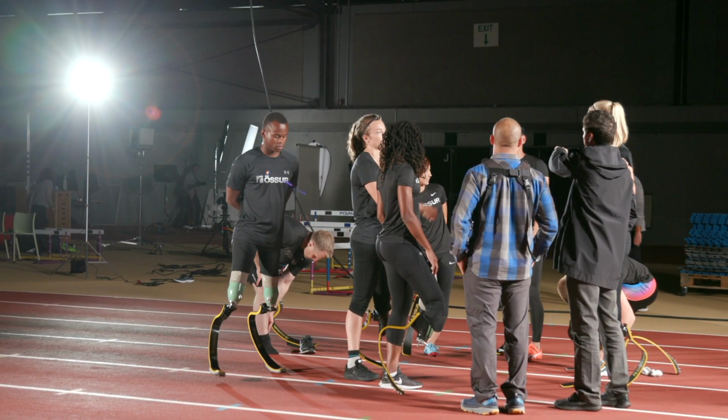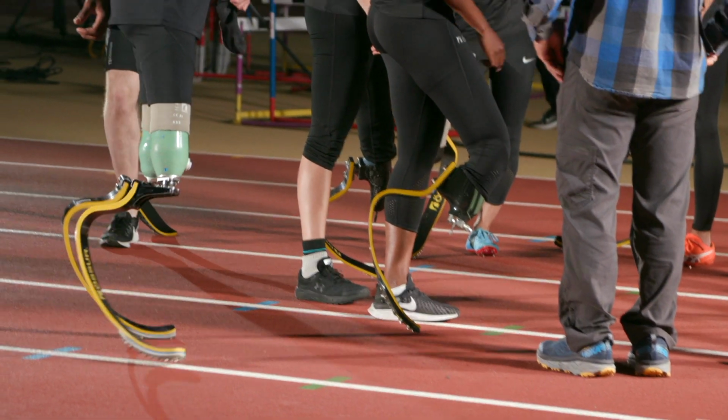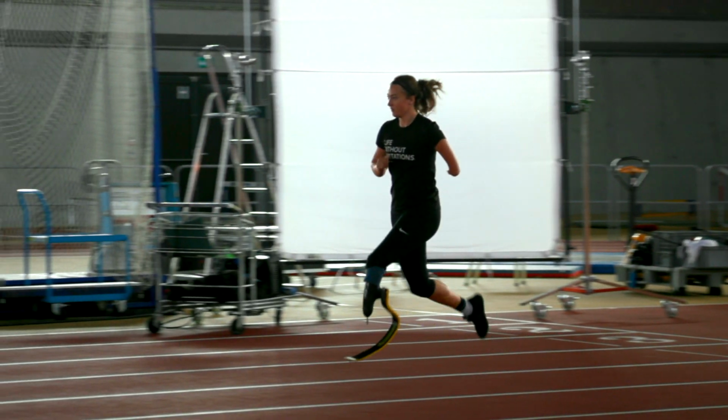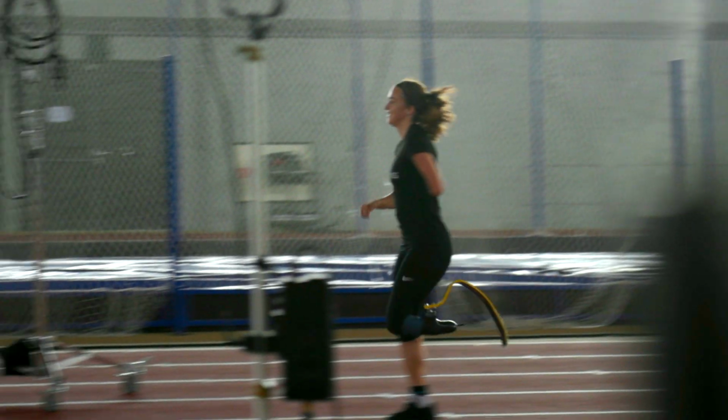Blades are essentially springs. They can't return any more energy than is put into them, but concerns have been raised about just how far development can take us. Is there a risk we go beyond merely the physical capabilities of the athletes? A carbon fiber blade is not able to provide active positive energy, and that is what the human leg does. So if you look at it just in that simple manner, you're always going to be slightly underperforming if you're reliant on a blade that is not able, like a muscle, to produce 200-300% of the power if you're contracting it in a sports activity.